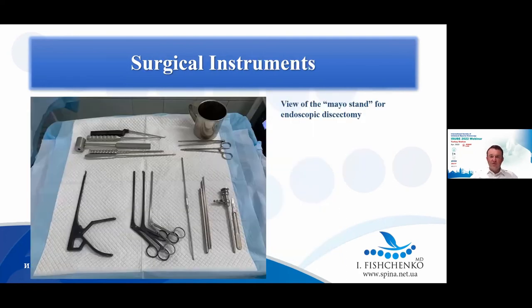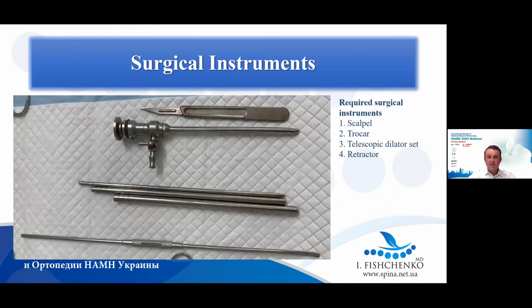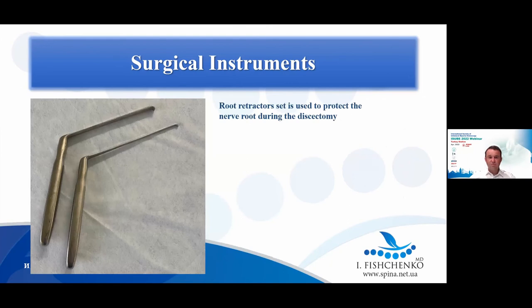I use a pituitary rongeur set, a big one with a 3 millimeter size, some upbite pituitary rongeurs, and two small ones for discectomy, to remove parts of the disc material. So we need a scalpel, a trocar, the set of telescopic dilators, the root retractors, and a retractor for different tissues.